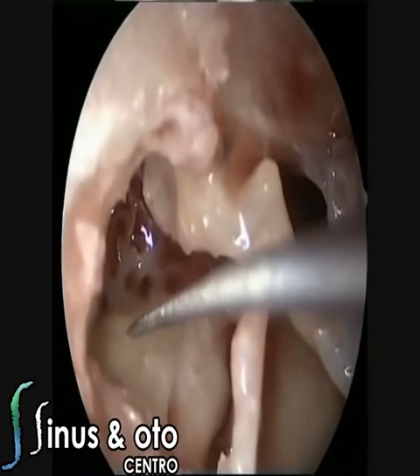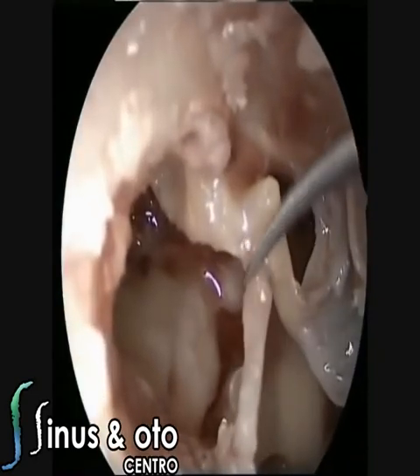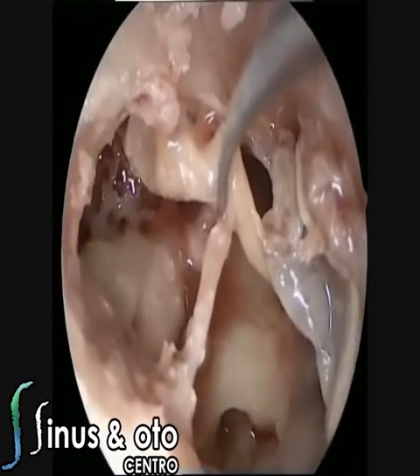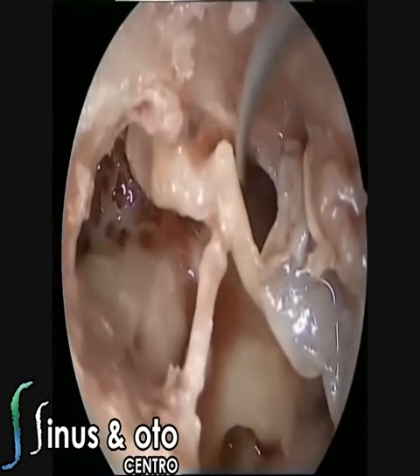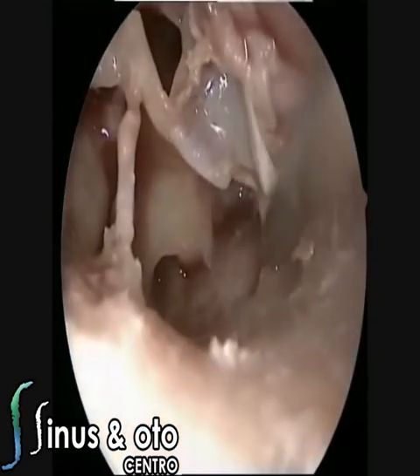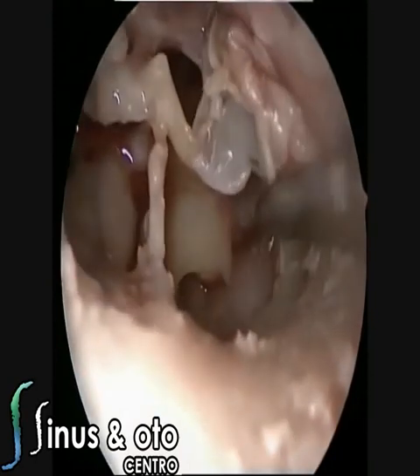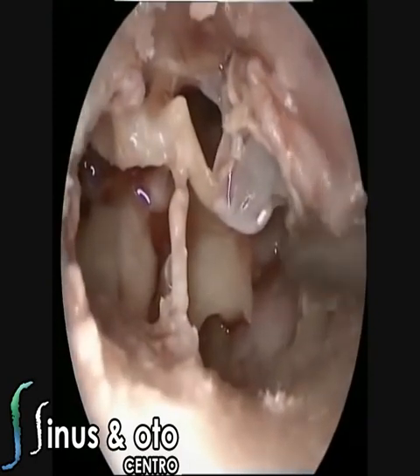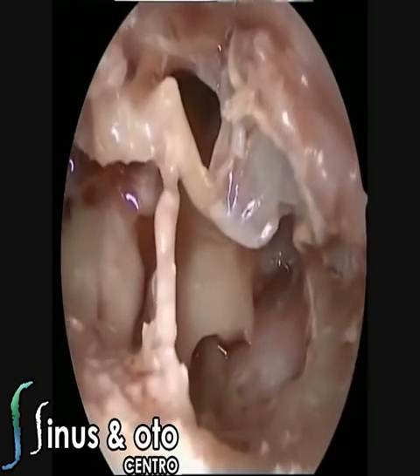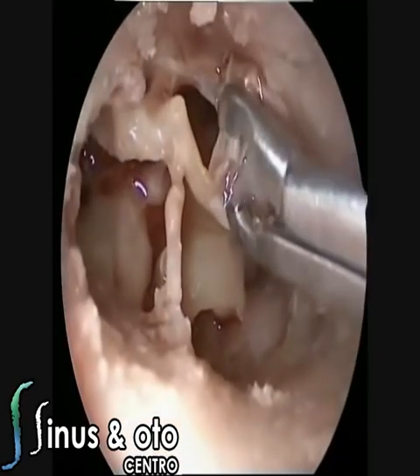So the lateral semicircular canal is there, the facial nerve is there, and can you see a bulge at the facial nerve over the oval window niche? The cochleariform process is there. As you can see, the cochleariform process is a very important landmark and a very important structure that holds the malleus in its place. The jugular bulb in this case is very high, so the hypotympanic cells are not very big, not very important structures in this specimen, because the jugular bulb is very high.